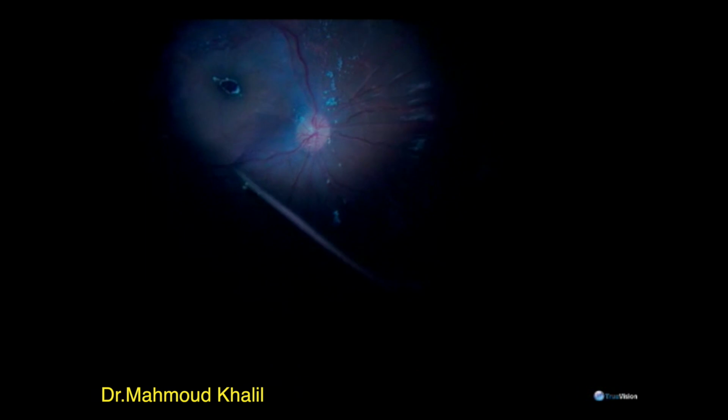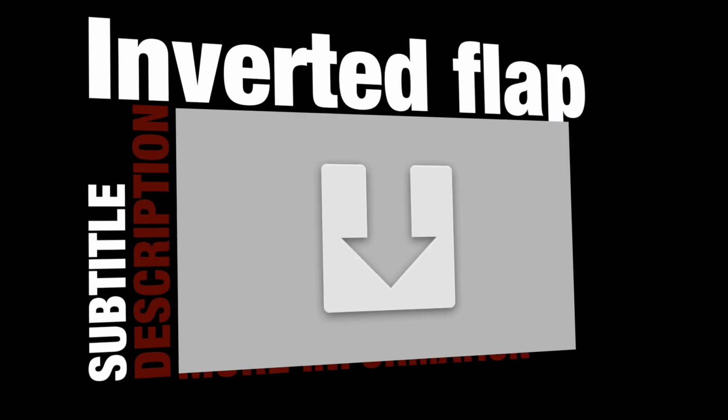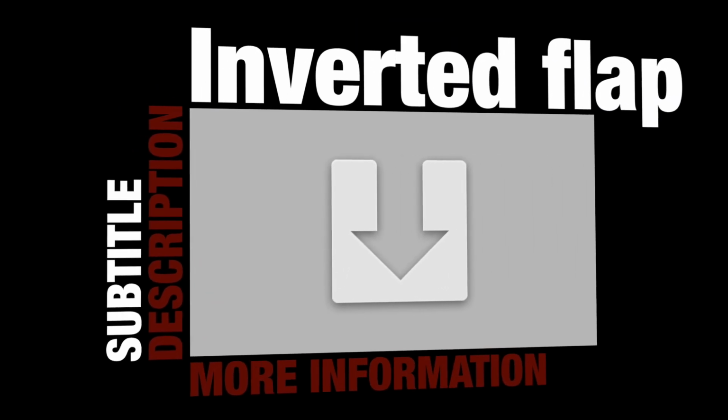This technique was successful in a very good percent of cases in closure of macular hole, especially in small ones less than 400 micron. The second technique is inverted flap technique.